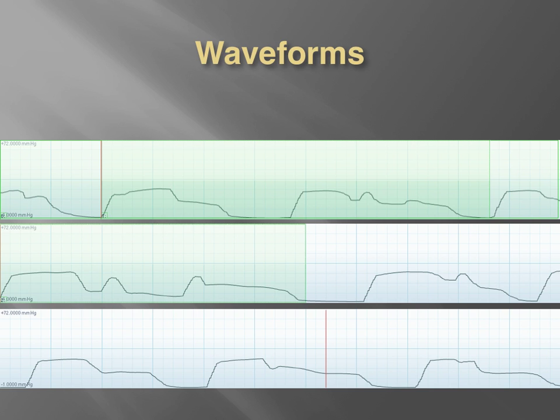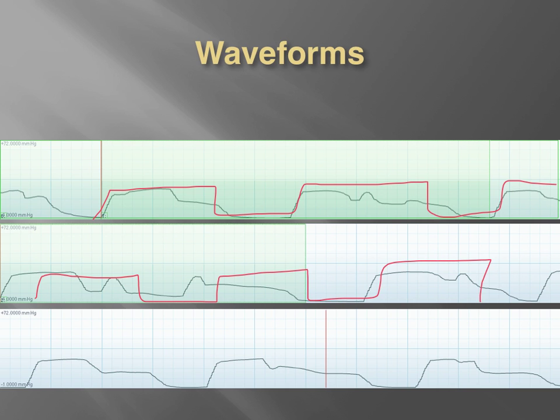And here's another set of strips, and this is all the same patient. If we look at this right away, we can obviously see a very consistent pattern of inconsistency. Okay, we don't have any regularity of normal waveforms anywhere, do we? If we're just staring at this going, what the heck's going on with the patient, then we're missing out on a very important opportunity of looking at our patient and comparing and contrasting what we're seeing.